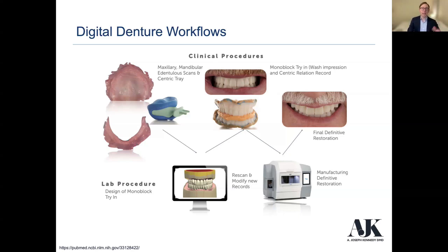So you can scan the patient's edentulous arch. We'll talk a little bit about scanning in another future webinar, and I'll give you some tips on how to do that, because there's a couple of things that you need to be mindful of when scanning these types of arches that are edentulous.